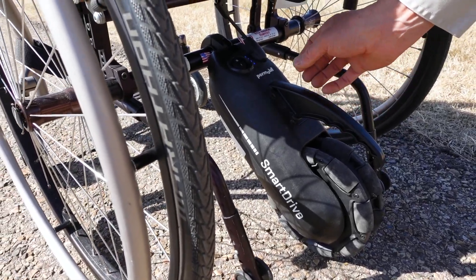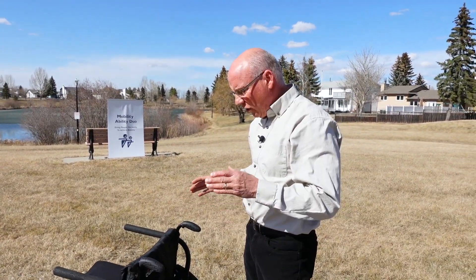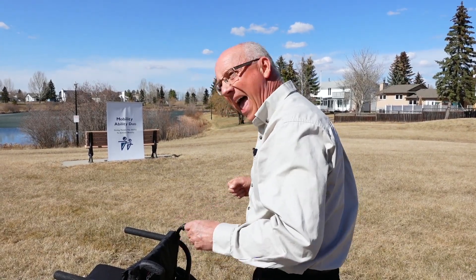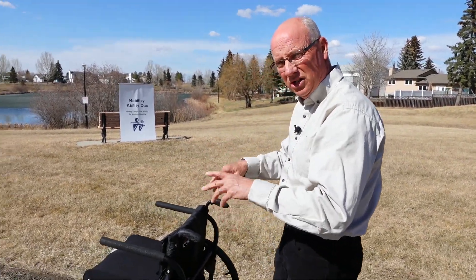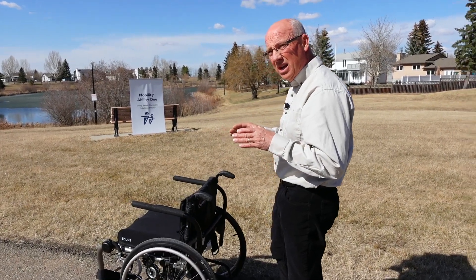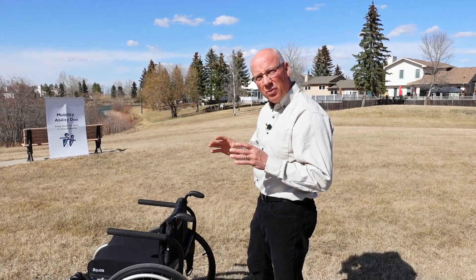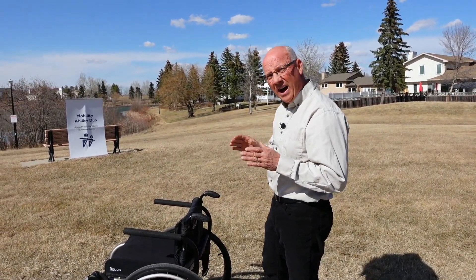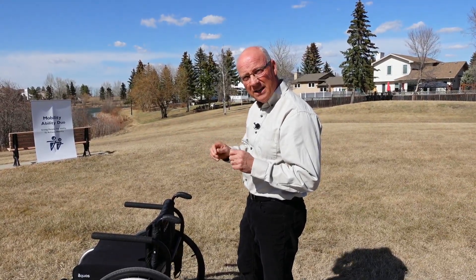This thing is 13 pounds, so it's the lightest. This SmartDrive add-on unit is the lightest in the world. If you're handling it or wheeling and you don't need the SmartDrive — you're in a tight area or something — you can just drag it along and it just rolls. So it's very light. It goes about 20 kilometers, so 12 miles approximately, and then it has a range speed of 5.5 miles per hour, about 8.8 kilometers.